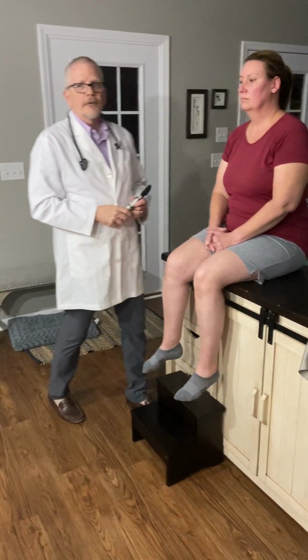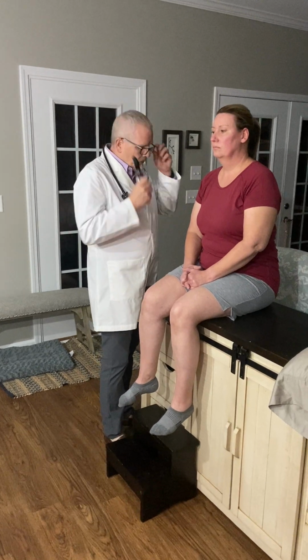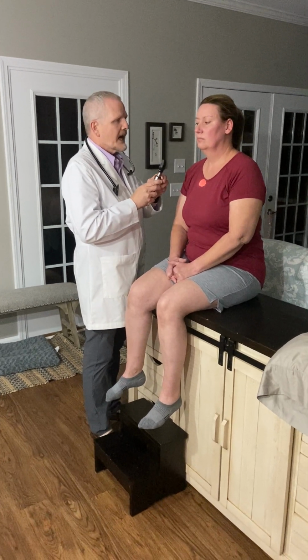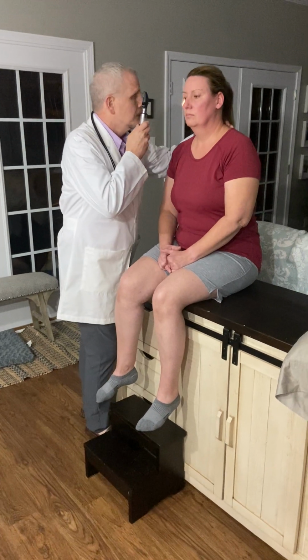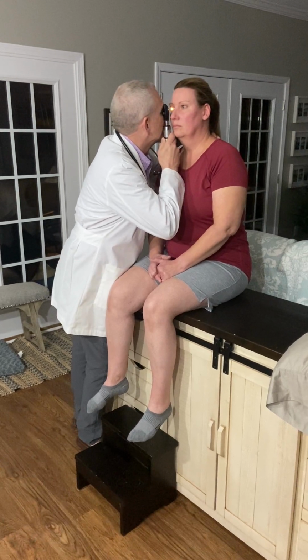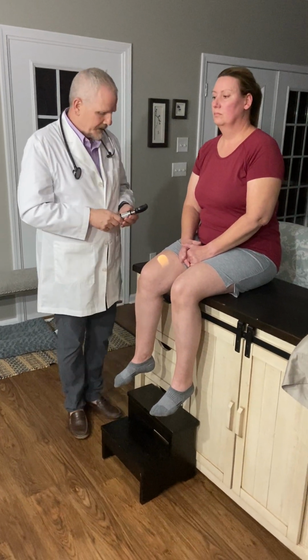From there, I'm going to do red reflexes with her. I'm going to do a fundoscopy with her. We're going to look at the red reflexes and the optic disc. Now I'm going to use my right eye to look at her right eye. We're going to come in at about a 15-degree angle. Red reflex is present. The optic disc borders were well defined and no papilledema present.